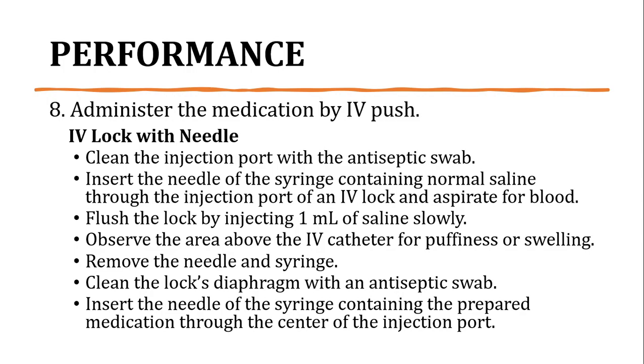First is clean the injection port with the antiseptic swab to prevent introduction of microorganisms into the vascular system of the client prior to inserting the needle. So, to maintain po yung sterility na procedure, ginagawa yung pag-clean ng injection port with the antiseptic swab before insertion of the syringe. Then, insert the needle of the syringe containing normal saline through injection port of an IV lock and aspirate for blood.